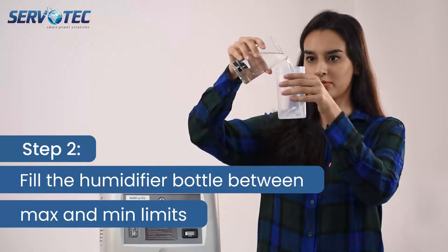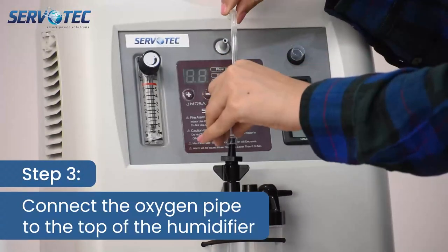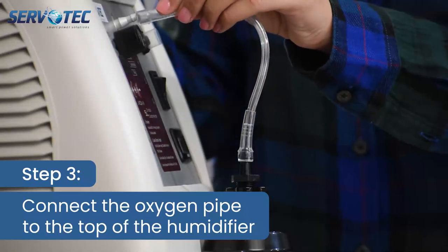Step 2: Fill the humidifier bottle within limits. Step 3: Connect the oxygen pipe to the top of the humidifier.